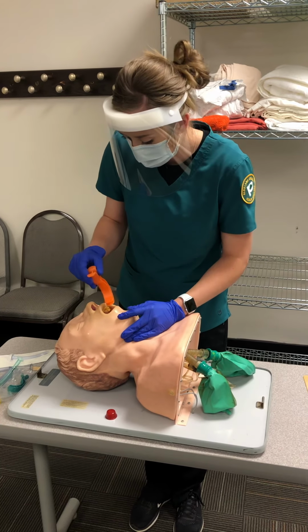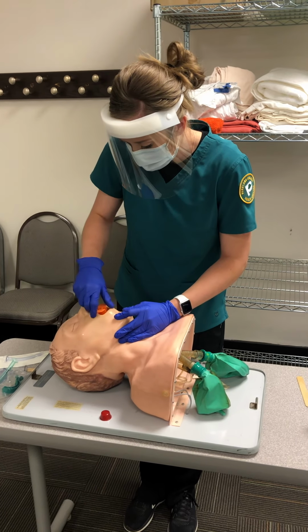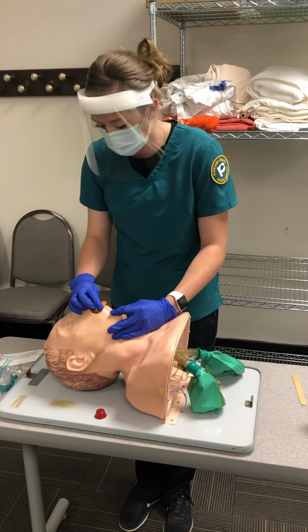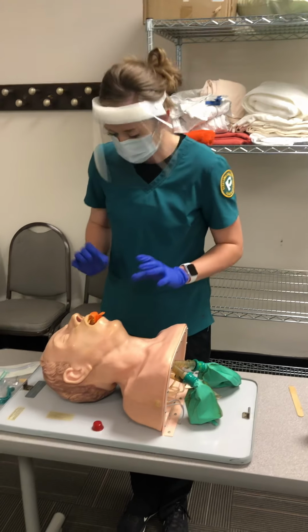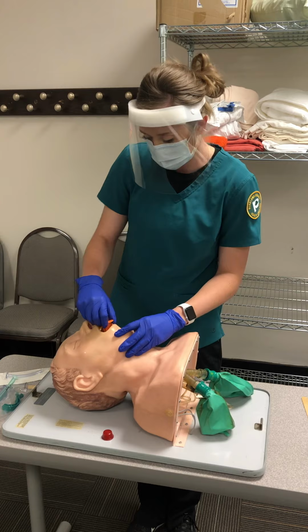I'm going to insert this sideways and then twist it to displace the tongue. If I have any issues with this, I can use a tongue depressor to help displace the tongue. I will then verify to make sure the placement is correct and that the airway is open, and then I will document this in the patient's chart.